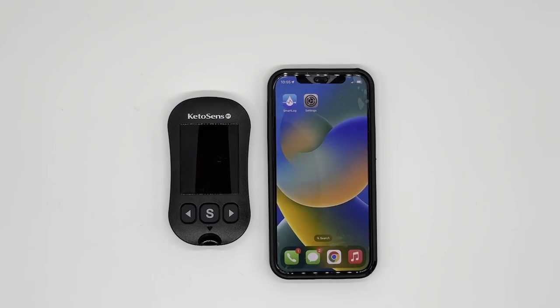Hello everyone, my name is Sun from iSense USA. In this video, I would like to show you how to pair KetoSense BT to your phone via the SmartLog mobile application.